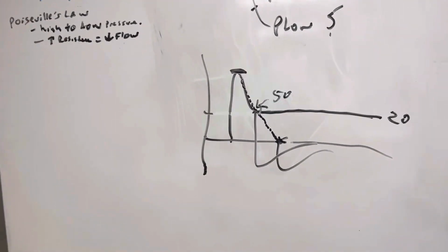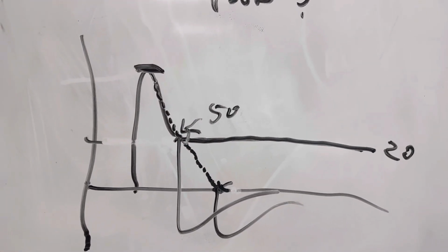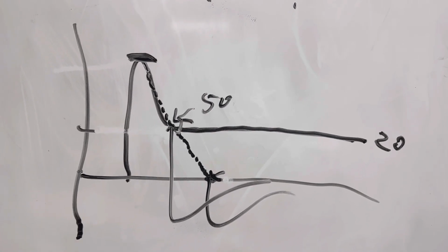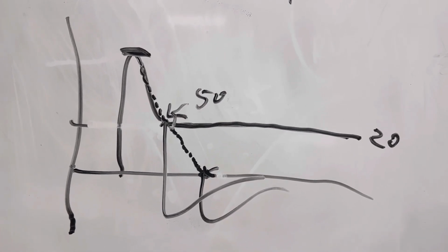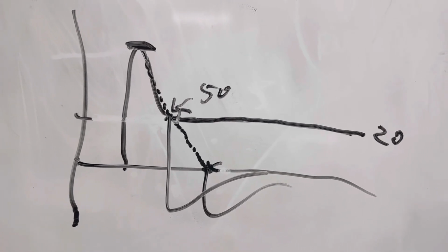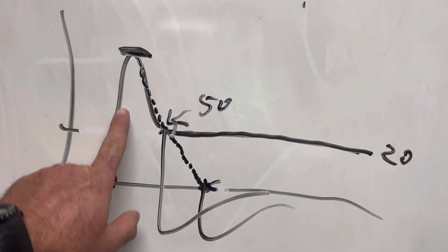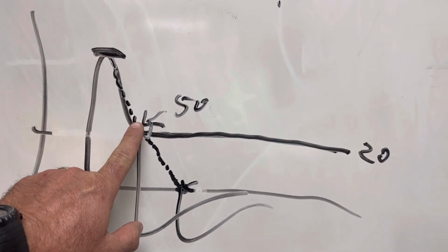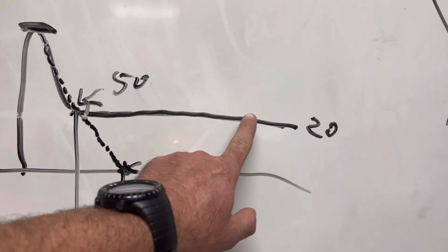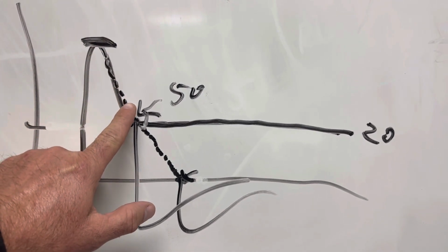So we have a patient who is on pressure support and has a leak. Let's say he has an uncuffed tube or an uncuffed trach or whatever have you, a known leak. With that leak, on his pressure support breath, you see this waveform. The flow goes in, the flow decelerates, and then at this point the flow stays constant at, let's say, 50 liters a minute. So if 100 liters went in, it slows down as the lung expands.